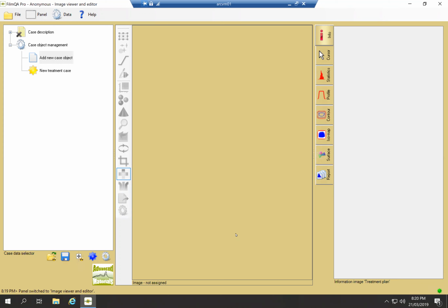G'day. This is a tutorial for using FilmQA Pro.